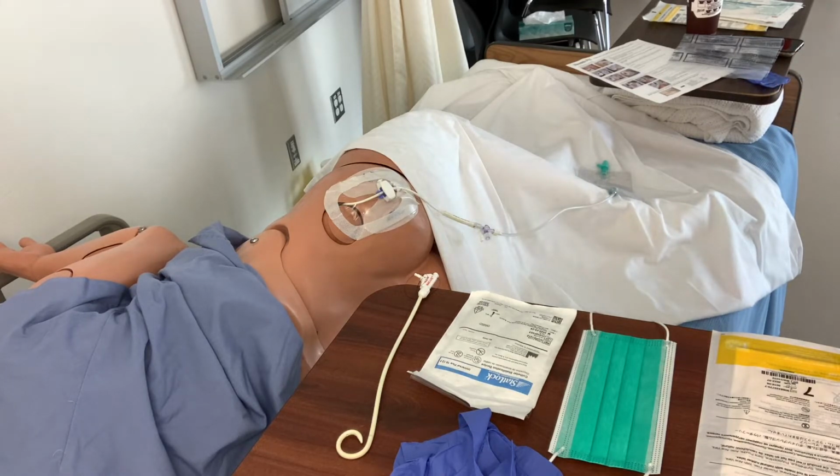There are a few little differences, but as far as the sterile technique goes, that's the same. I just want to walk through the pieces and parts of the percutaneous drainage catheter so that you have a better understanding when you're in clinical. I'm going to follow the Health PEI Policy and Procedures manual for this.